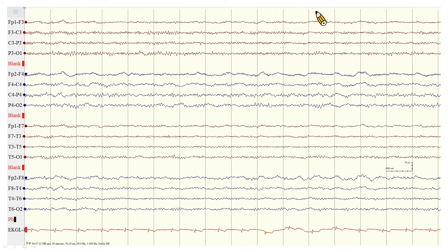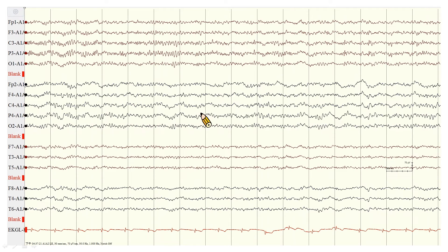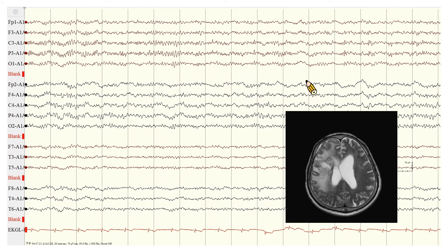Let's look at this EEG in double banana montage — left parasagittal, right parasagittal, left lateral, and right lateral. We can see nearly continuous polymorphic delta activities over the right hemisphere. Changing to A1-A2 montage, the polymorphic delta activity still exists, indicating a structural lesion or subcortical dysfunction. This is a case of GBM over the right hemisphere, status post operation.